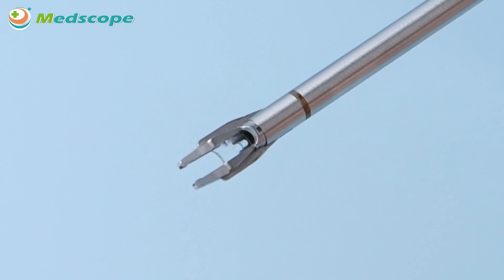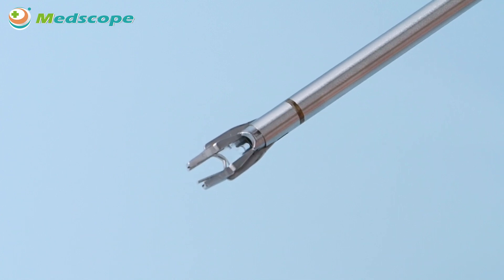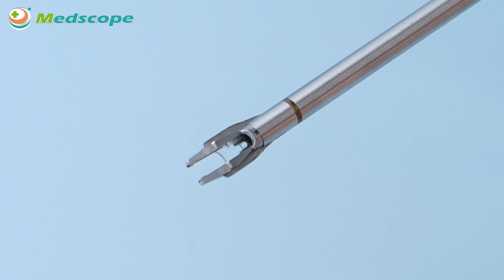Advantage 2: Advanced Pitch Loading Clip Delivery System. Our unique pitch loading clip delivery system offers reliable and stable device actuation, which reduces unwanted possibilities such as clip droppings and clip stuck.